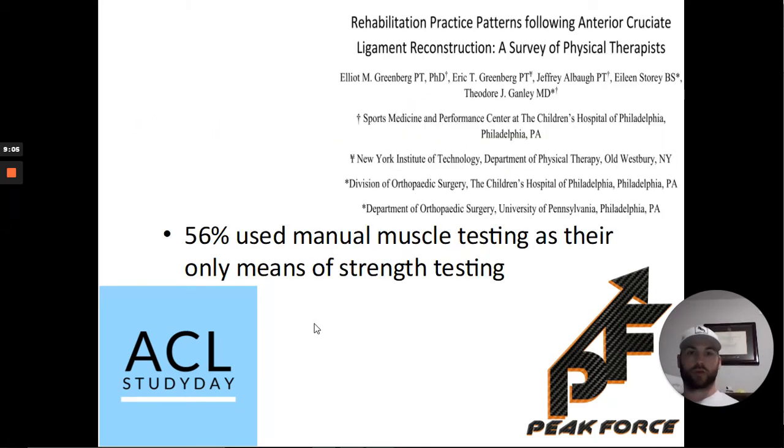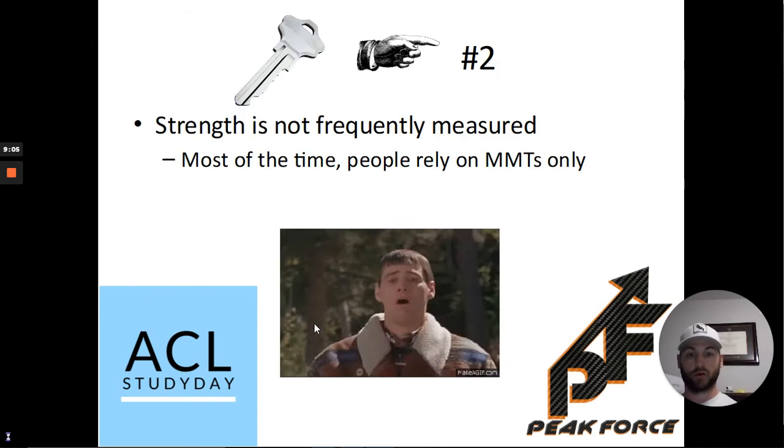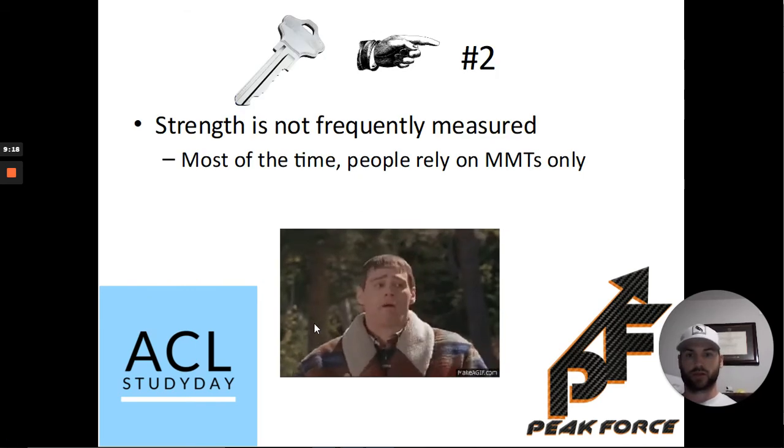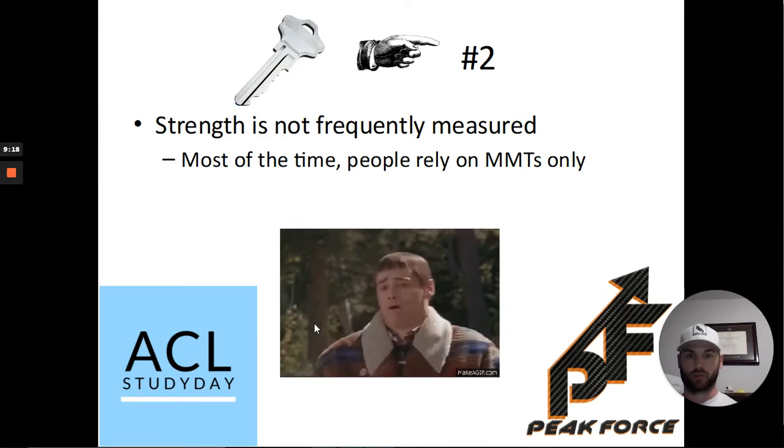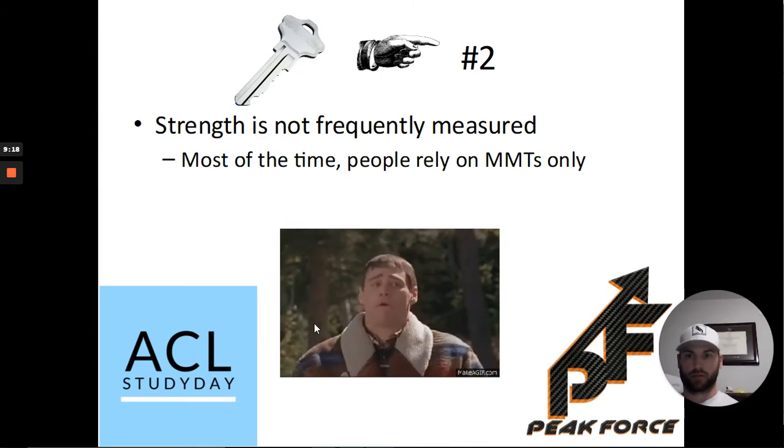Well, hopefully as PTs and physios, we do a little bit better than that, right? Well, really not that much. The rate was about the same in a very similar survey. So most of the time, people are just using these manual muscle tests and not using a real objective measure. And this is kind of my visceral reaction to that. It makes me a little bit queasy.